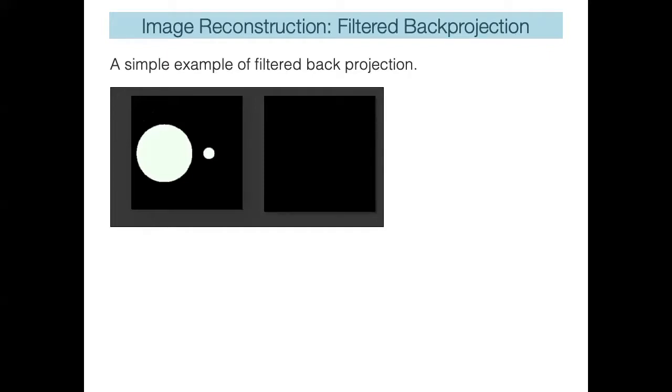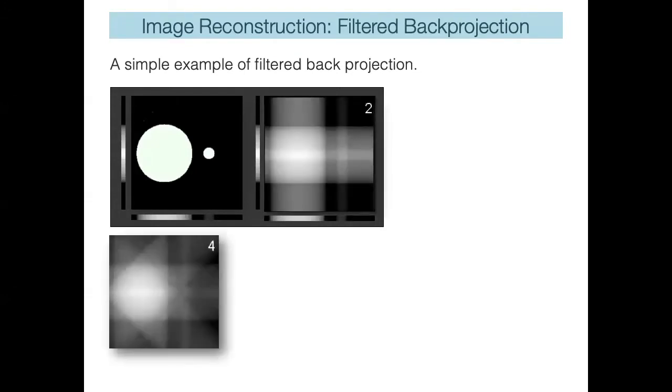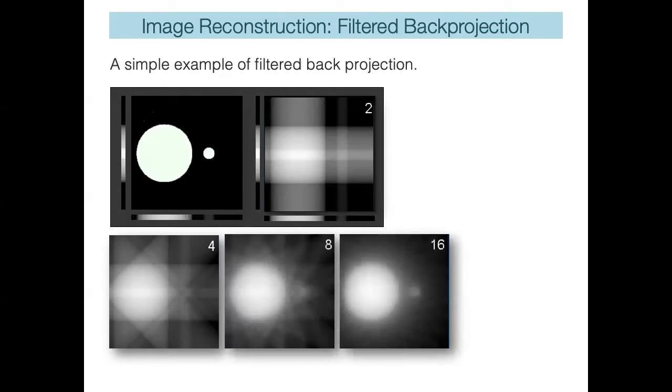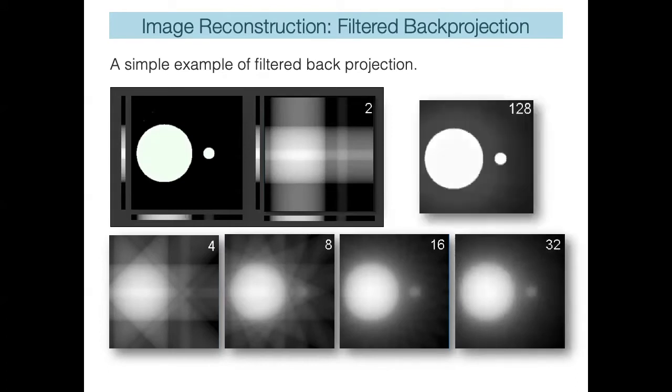When you have an image, you can project it for different angles. And if you project it for one angle or for several angles, you can then get your image reconstructed through a filtered backprojection. And that can be done through many iterations until you go from your original data acquisition to your actual image.